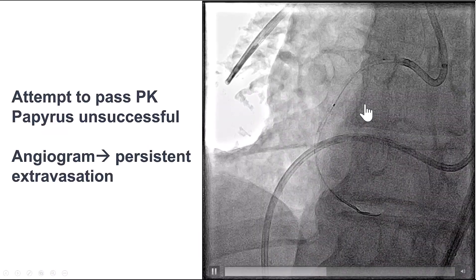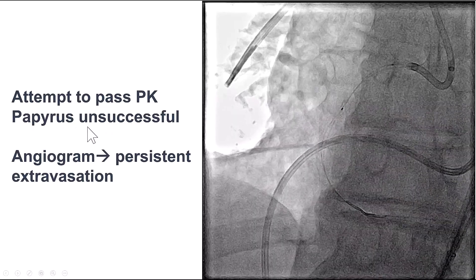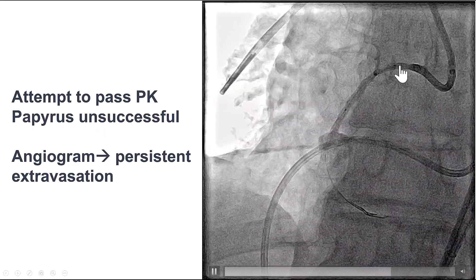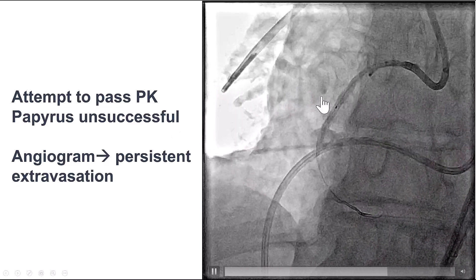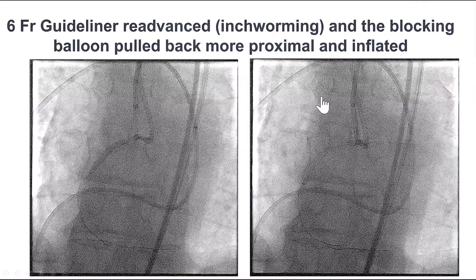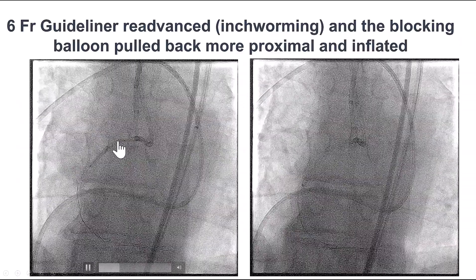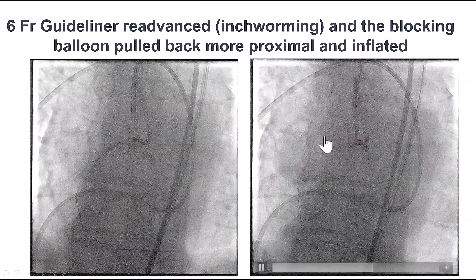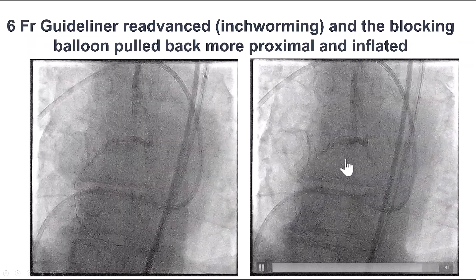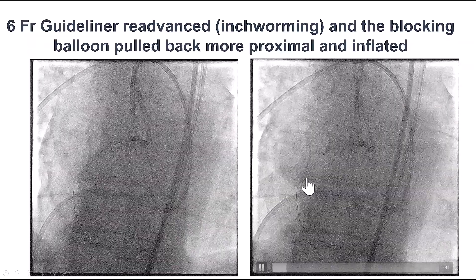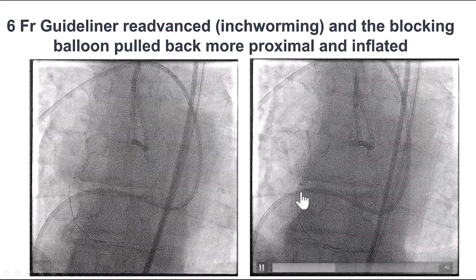The idea was to provide more support for delivering a Papyrus covered stent, but unfortunately we were unable to deliver the Papyrus — it would not go past the mid-right coronary artery. So we moved the guide extension, the GuideLiner, further down using the inch-worming technique, until the GuideLiner was all the way in the mid-RCA.